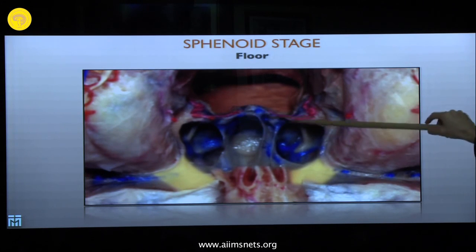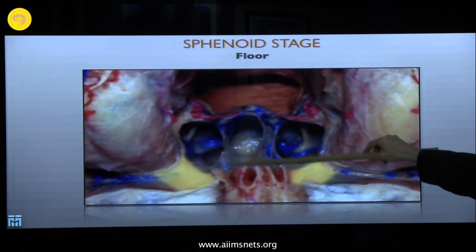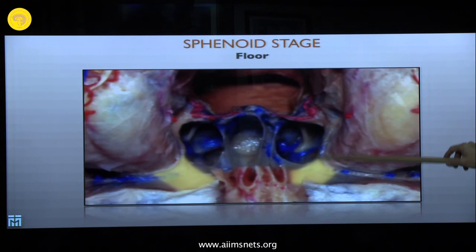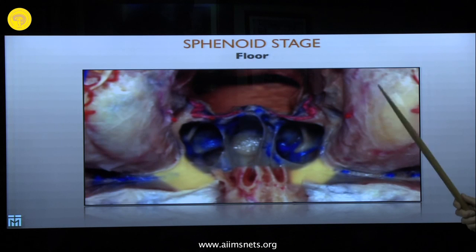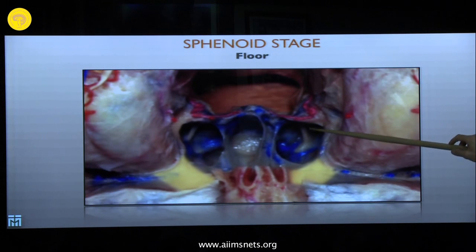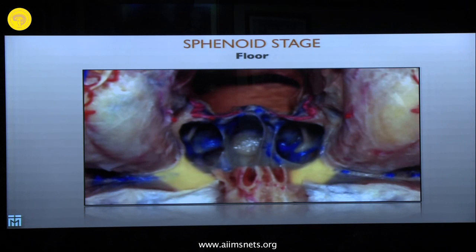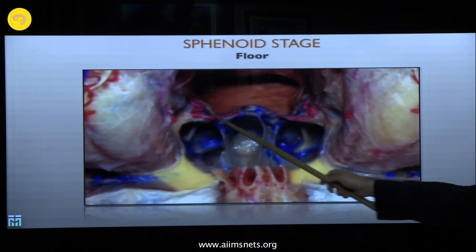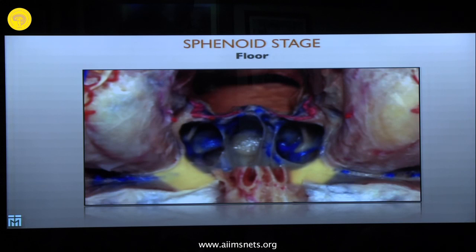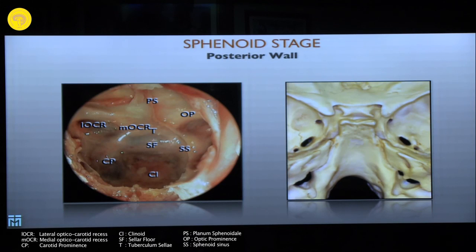Looking at the floor of the sphenoid sinus, you see the anterior wall and some septae. In a well-pneumatized sphenoid sinus you can see elevations on the floor — these are the elevations of the vidian canal. The vidian canal runs into and sometimes above the floor of the sphenoid sinus, running to the genu of the carotid artery at the level of the foramen lacerum. The most important structure for us is the posterior wall of the sphenoid sinus.